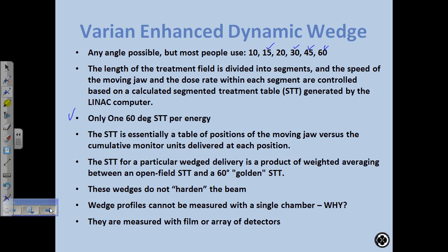Okay, these wedges don't harden the beam. They don't harden the beam because there's no metal in the way except the moving jaw. If the jaw is in the way, it gets zero dose, so there's no hardening of the beam.